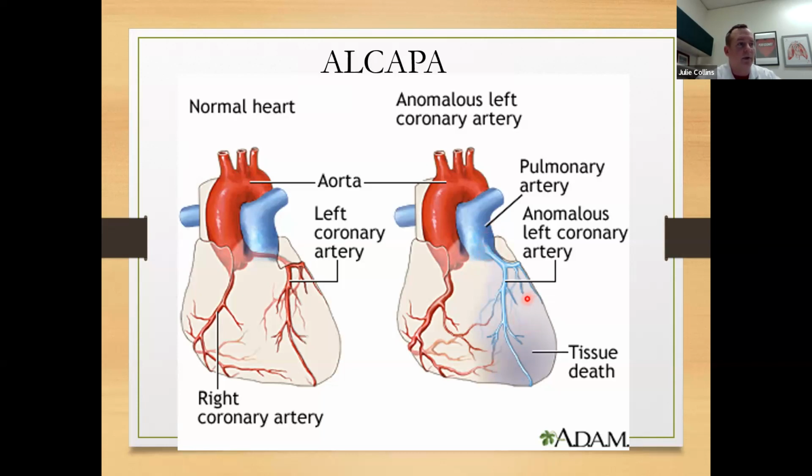And you would definitely want to give good cardioplegia, but just know that the cardioplegia you're typically giving is just perfusing this right coronary artery. So the more cooling will give you more of a cardioprotective effect. They may go on and give separate ostial perfusion down the anomalous coronary here, okay?